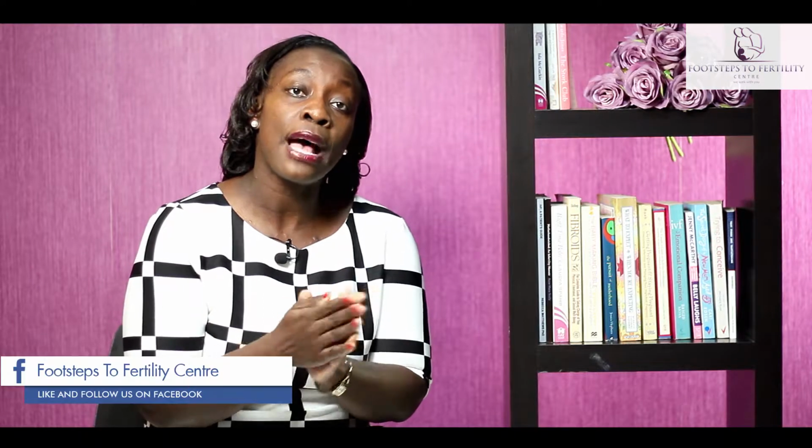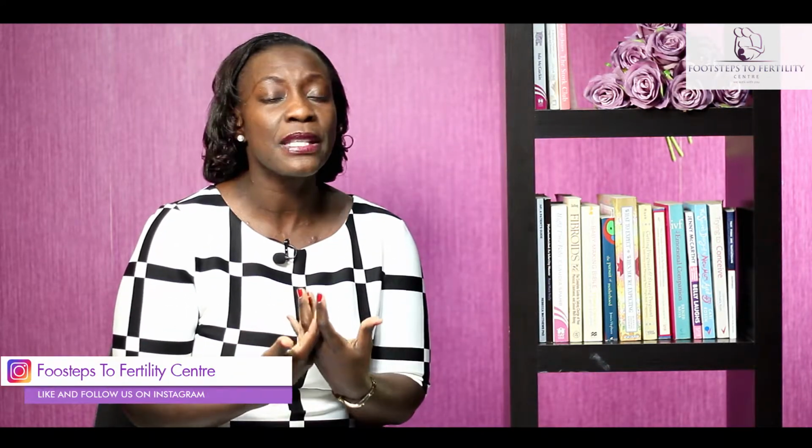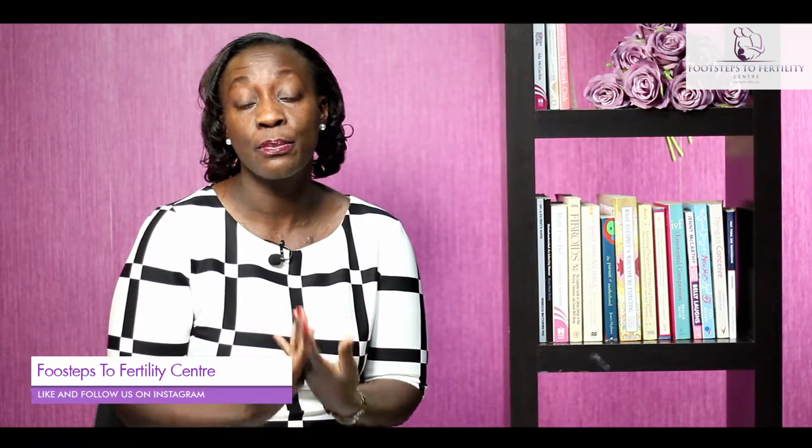Sometimes the infection can occur, and that can be very bad for our uterus, and the layers can actually stick together. So another reason we could do a hysteroscopy is to separate those layers and actually give you space for the baby to implant. So hysteroscopy is a very, very important procedure.